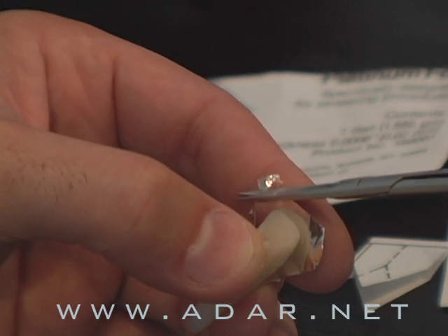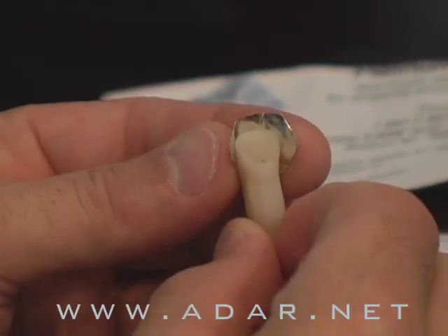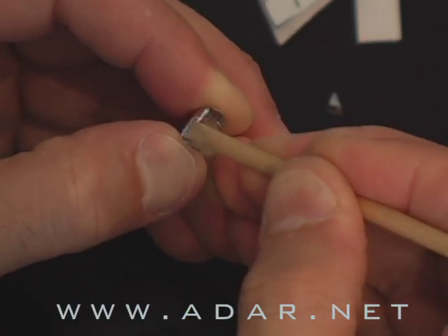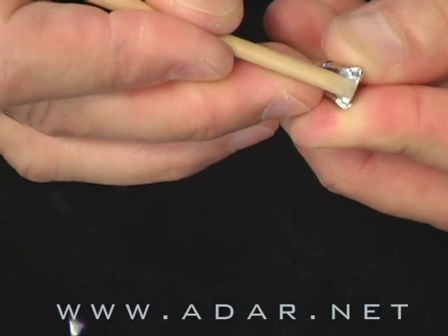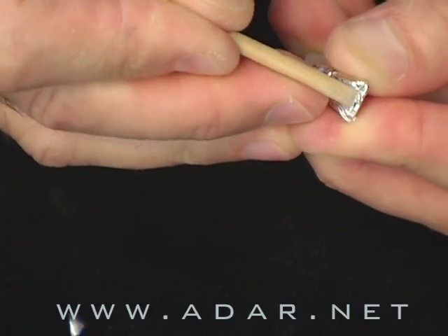In this DVD, I'm going to teach you how to fabricate porcelain veneers with the platinum foil technique. I've been using this technique for many years and it's the best and most efficient way to fabricate veneers. I'll give you some guidelines on indications — where you can use foil and where you can't — and I will teach you all the tricks and techniques that you need.